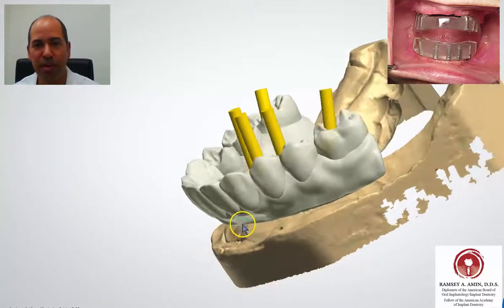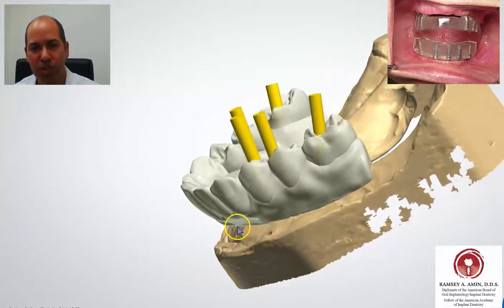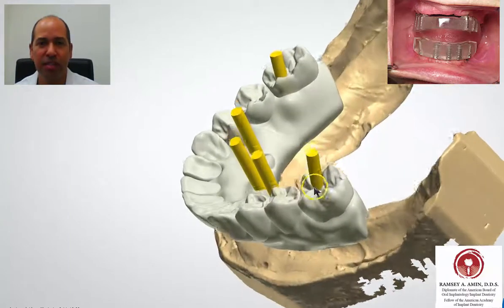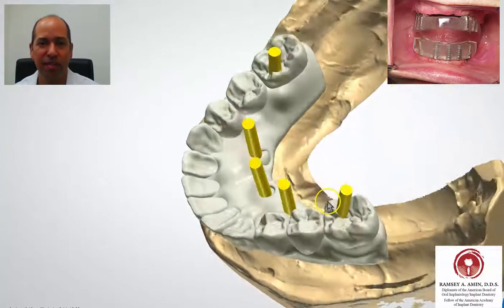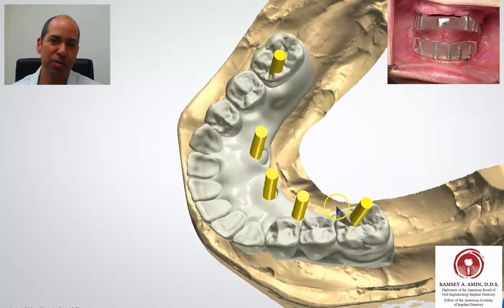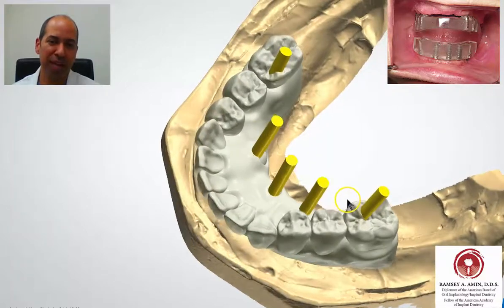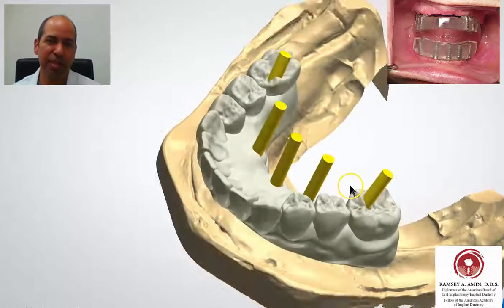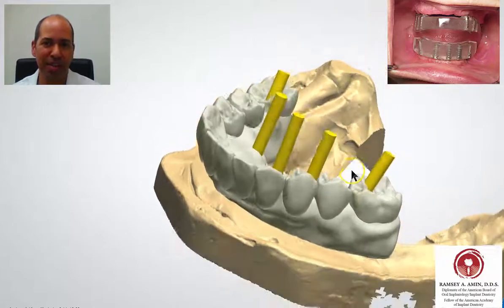That upper right image is what's called the verification jig. It basically verifies that my digital molds or regular molds are accurate and that everything is going to fit passively.